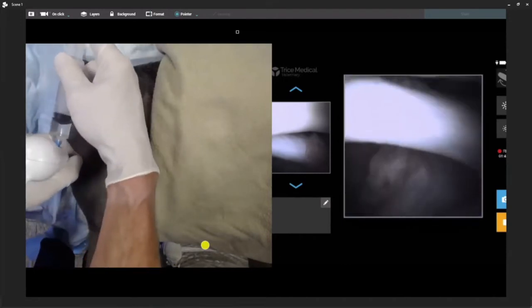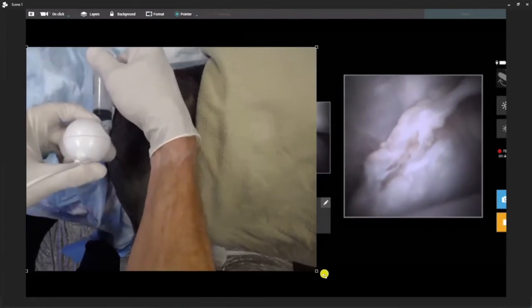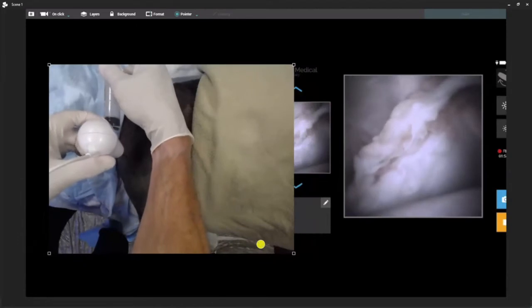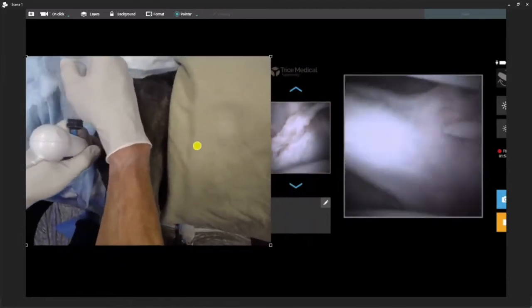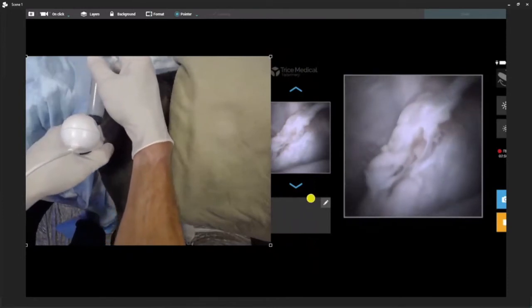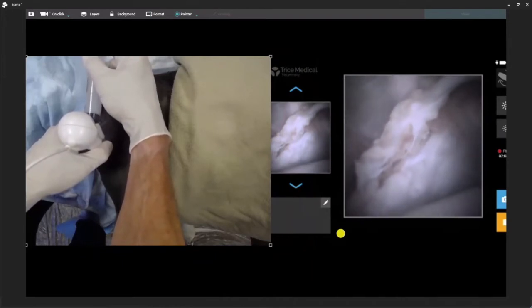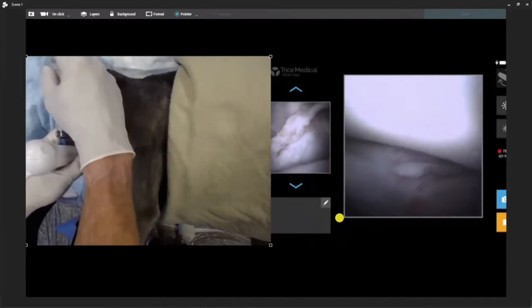I think you guys watching at home can appreciate — the clarity is pretty good. I'm pretty happy with the image quality we're seeing here. If you place your free-chip camera, your HD system, or whatever other technology you're using, I think this can run very closely neck and neck. It's not better than some systems I've worked with as far as clarity, but it's very competitive. So we'll go ahead and stop our video.